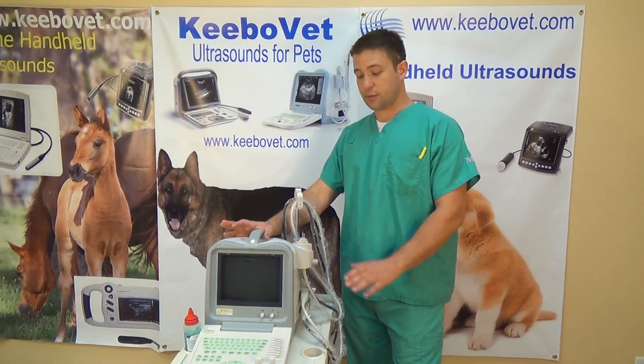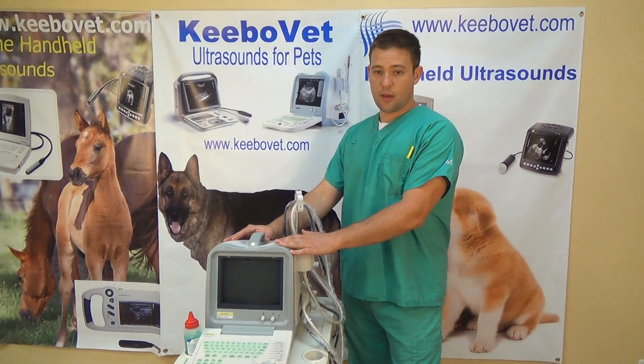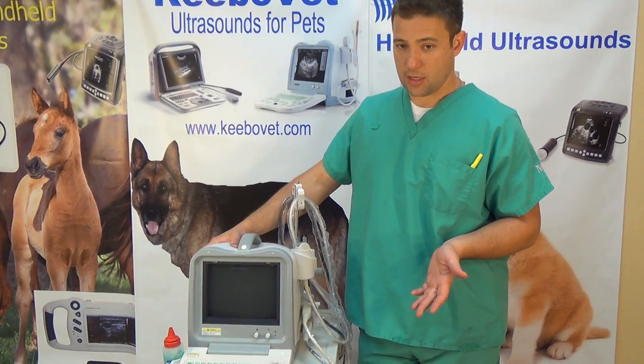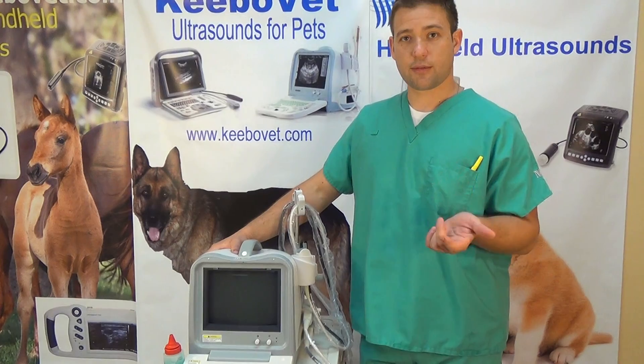This machine comes with other languages preset. You can have French, Russian, Chinese, English of course, Portuguese, and Spanish.